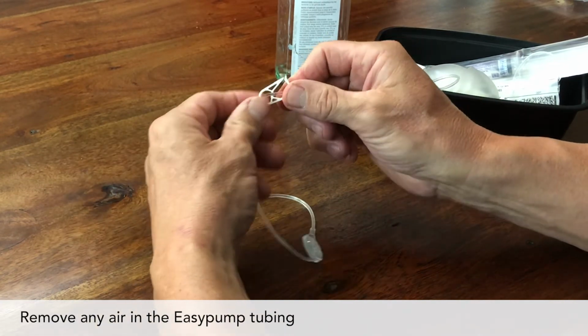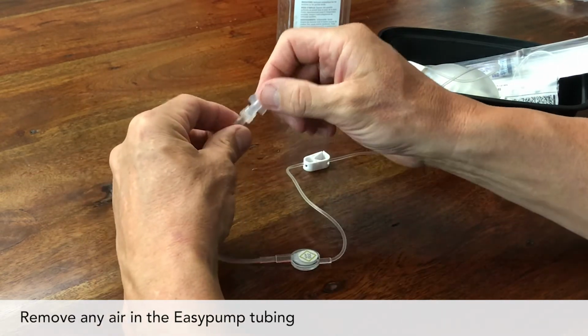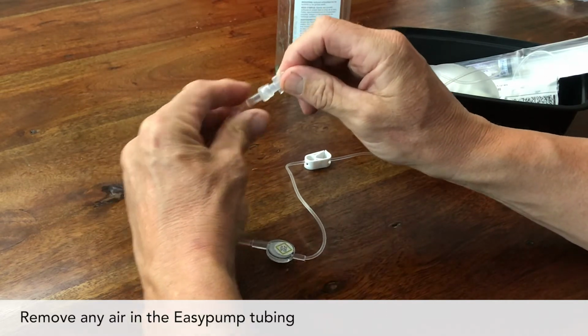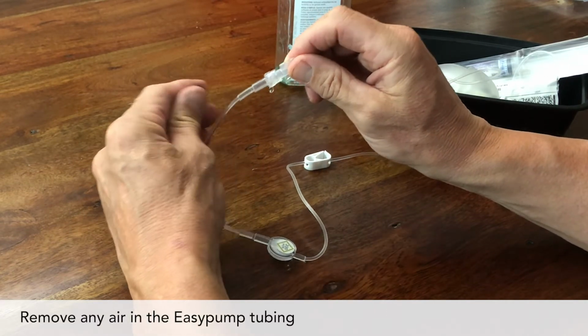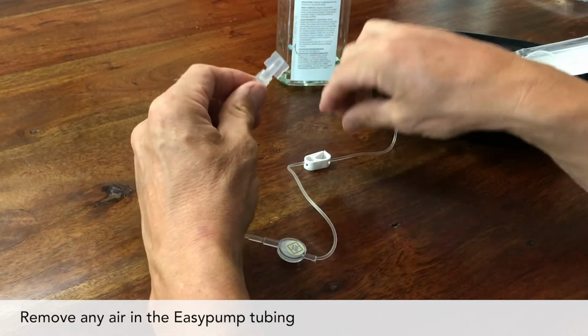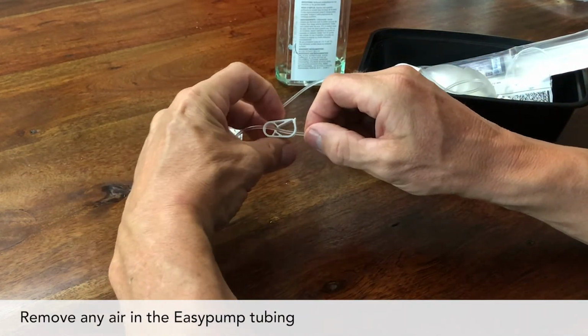Open the clamp on the pump tubing to let the medicine flow. Twist the cap on the end of the tubing slightly to loosen the cap. This will push any air out of the tubing. Once the tubing is full of fluid and you see a bubble of fluid at the end tip of the tubing, close the clamp on the tubing.